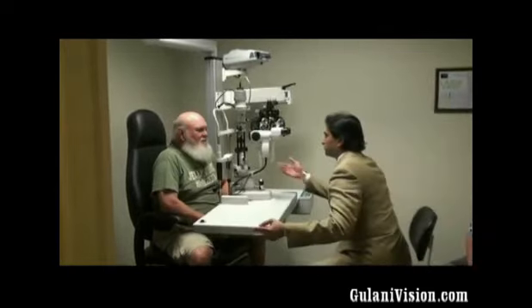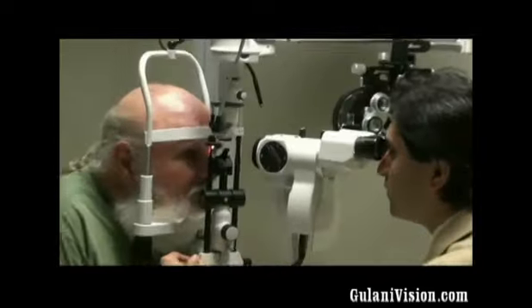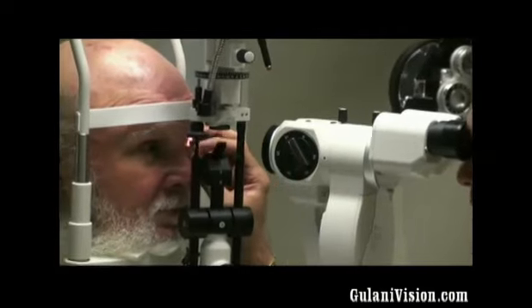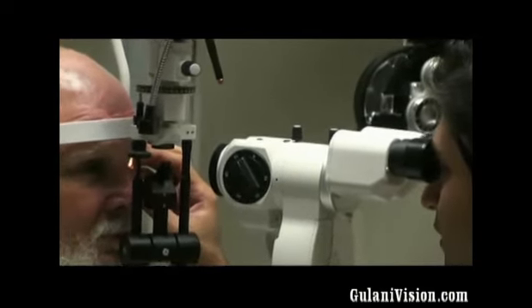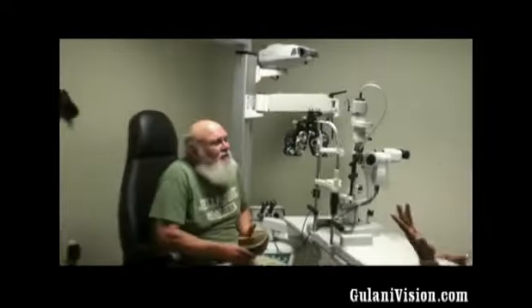Roger, keep your chin right there. Wonderful. Open your eyes. After surgery, we did the lamellar transplant. Open your eyes wide. Wonderful. Looks nice and clear. Very well settled. Fantastic. How do you feel, Roger? You've had a lamellar transplant?